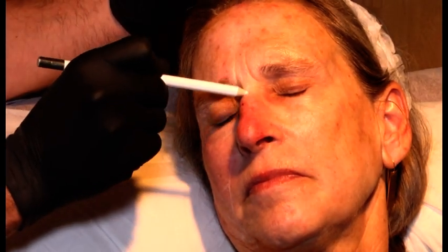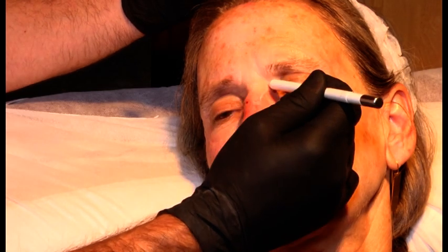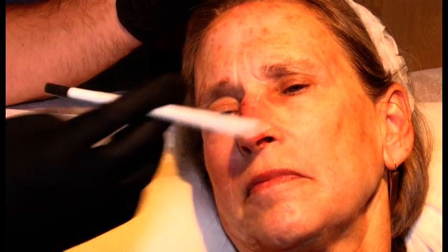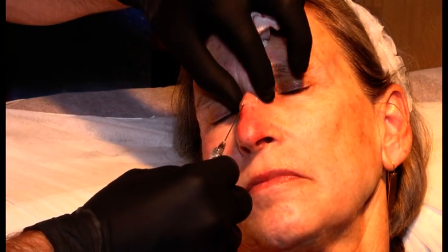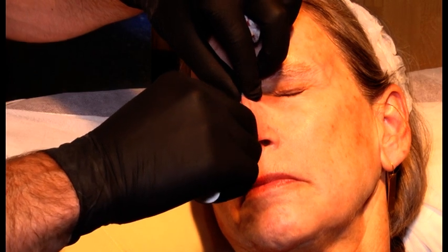So the dorsal nasal arteries are lateral to the midline. So this is a midline. The dorsal nasal arteries are here, and they're connecting with the supratrochlear arteries, right? So we have to avoid hitting those, but they're usually lateral to the midline. Of course, anatomic variation, everything's possible. So they are also located subcutaneously. So if we want to be safe, we have to go sub-SMAS. So we lift up, click through, and I feel periosteum.